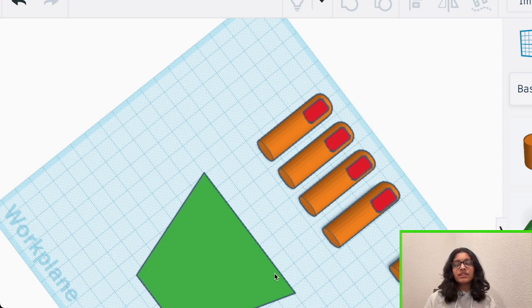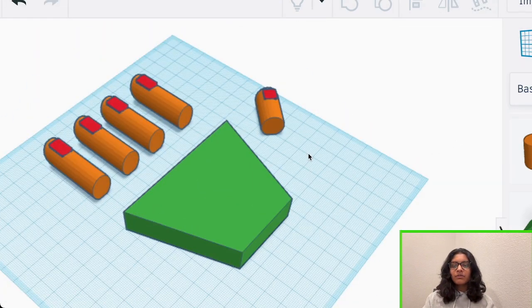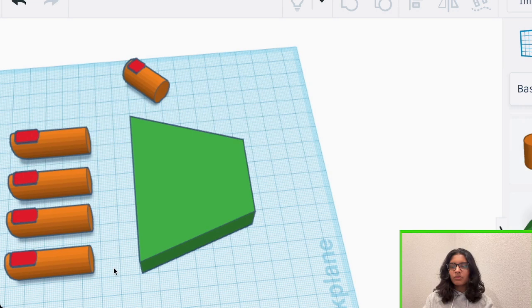After this, you can adjust the spacing and orientation of your fingers to match more of how a hand is actually structured. Now the next thing we're going to do is we're going to make the middle joints of these hands. The reason there's so much space between these two things is that we just did the top joints of each of these fingers, but now we have to make the middle joint.